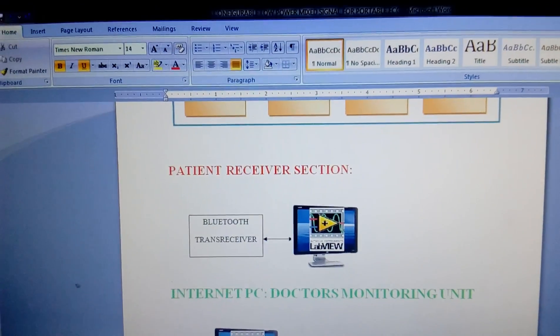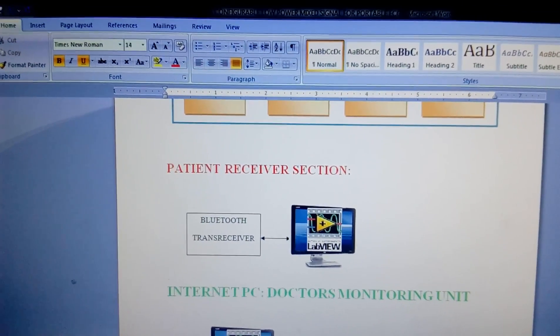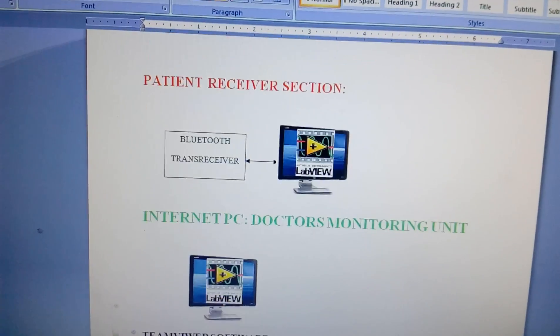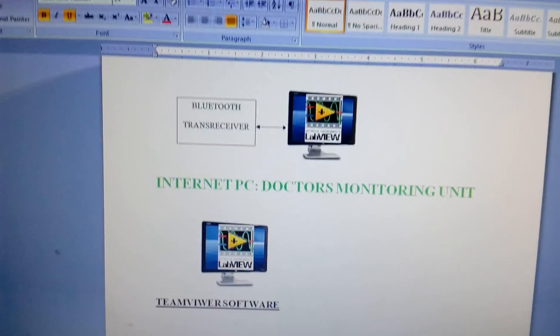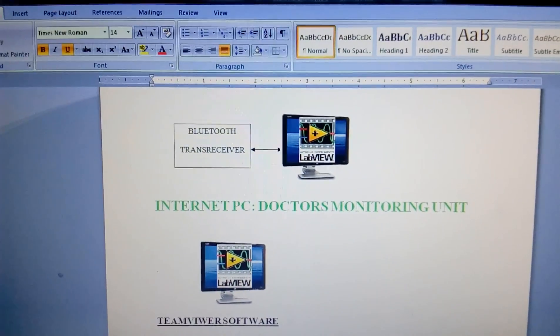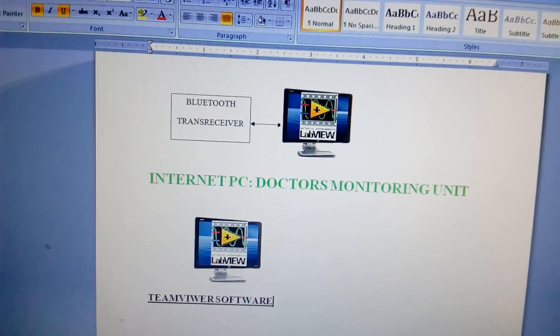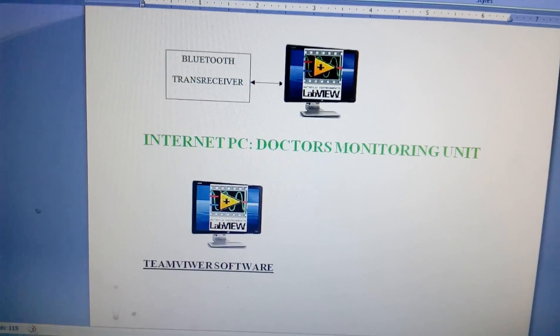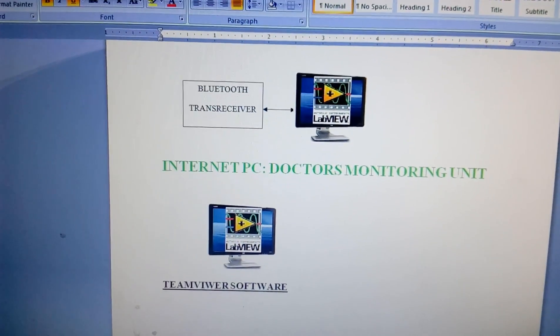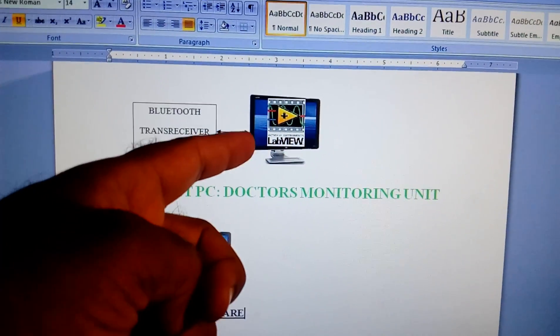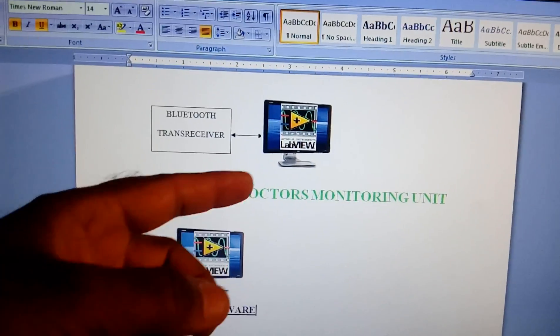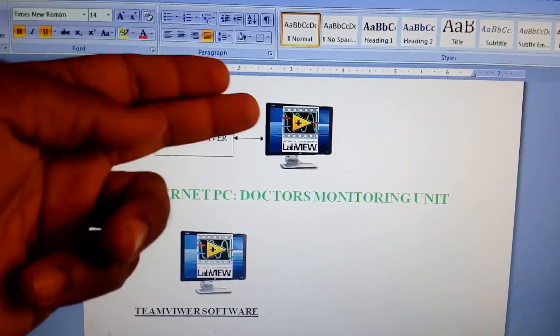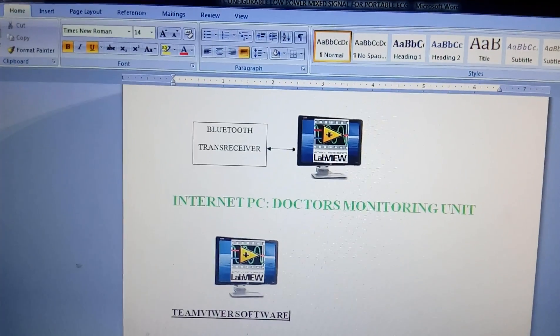We are displaying the data onto the LabVIEW in the form of graphical symbols. The doctor is far from the city or any area, so doctors have to see the data onto the TeamViewer software using a doctor's unit. We are taking the input source to the username in TeamViewer which has a username and password that should be given to the doctors.